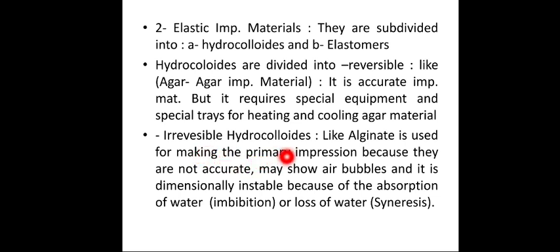Irreversible means when it is mixed, it cannot be reused. Alginate is used for the impression for the removable partial dentures and cannot be used for the precise work of the fixed crowns and bridges.